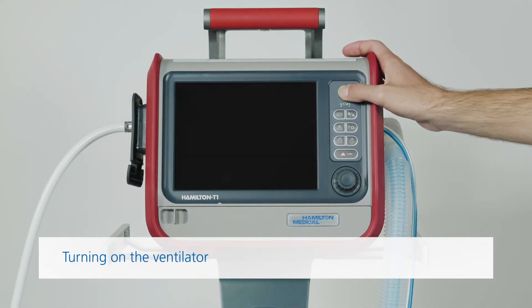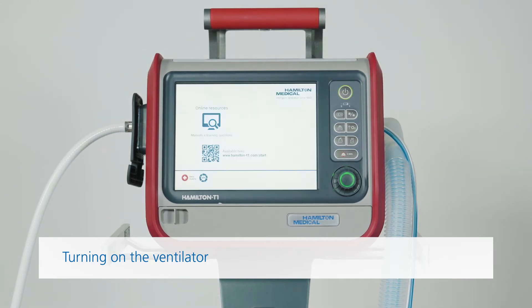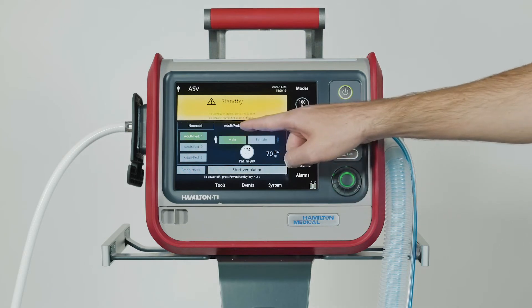Press the power standby key to turn on the ventilator. The ventilator will automatically run a self-test. Once that's finished, you can go ahead and select the correct patient group.